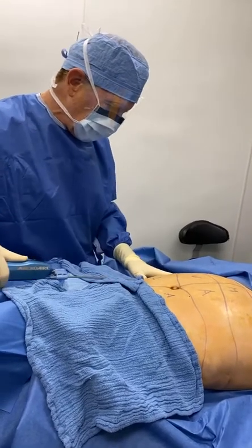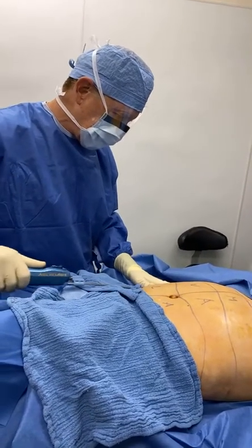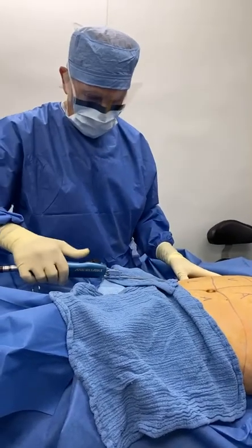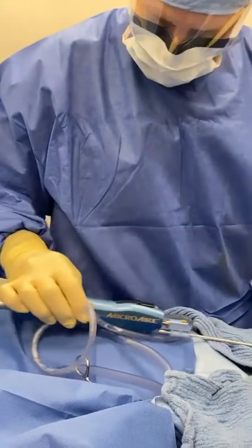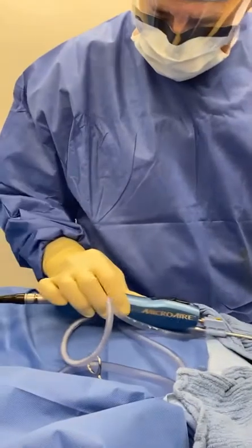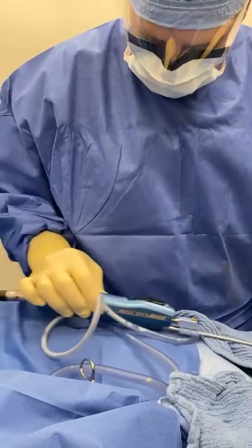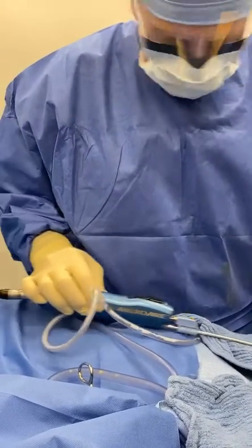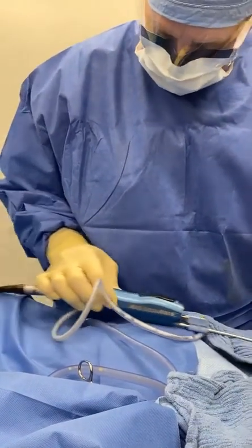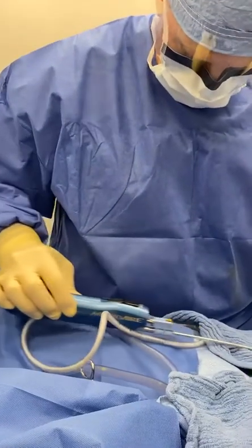We're going to do a liposuction to the inframammary area, upper abdomen, and lower abdomen. There is absolutely no bleeding when we do this here at the Cosmetic Surgery Center. The fat collected — it's white, it's yellow — just incredible, and it's just an unbelievable result.